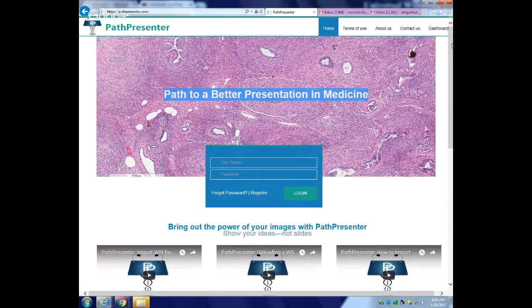Today I'm going to talk about how you approach Lichenoid Dermatitis. I'm going to use the platform that we built for presentations called Path Presenter. Initially, I'll just show you how to use Path Presenter for a brief 10 minutes and then move towards the actual presentation.